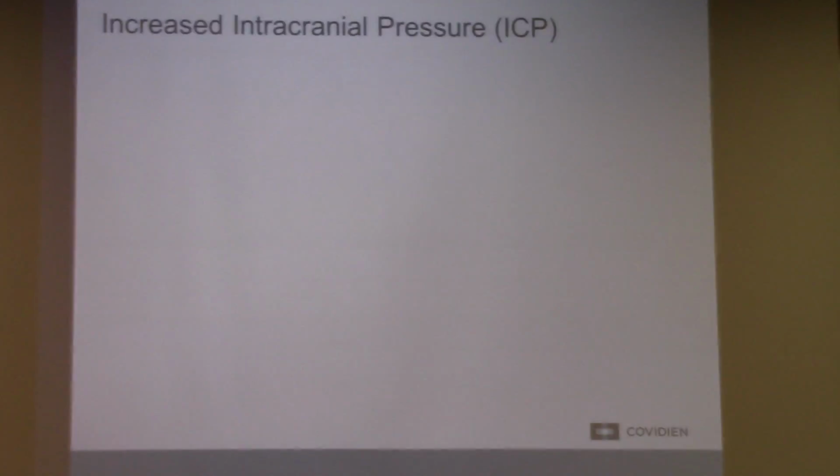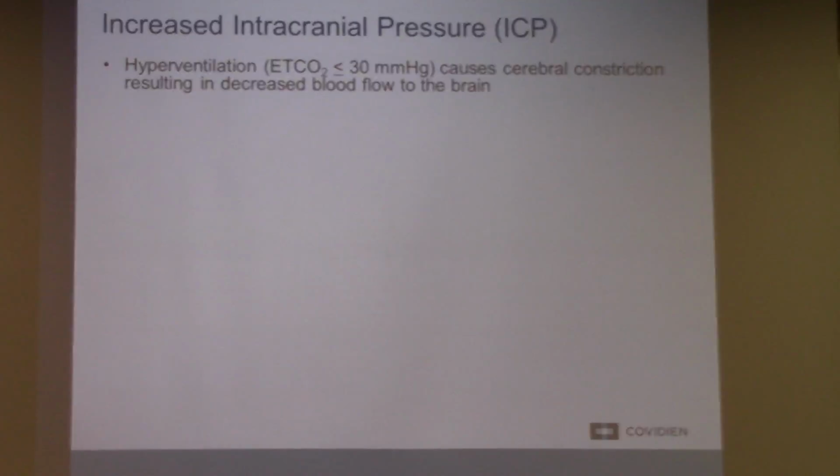because that's what the brain's looking at. Well, it's looking at PaCO2, but end-tidal CO2 is a result of PaCO2. Okay, they're fairly close, unless there's a major lung pathology, trauma, or medical. For the most part, PaCO2, and in shock, really, really sick patients can have a gap, but for the most part, they run fairly close to each other.